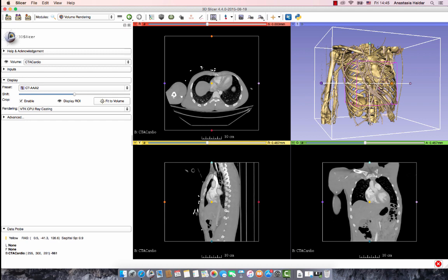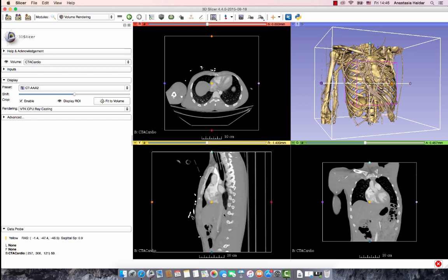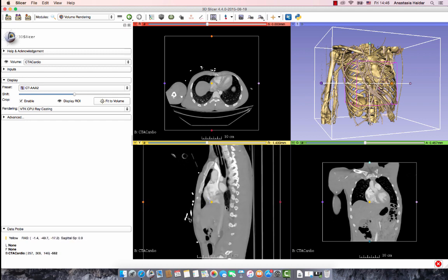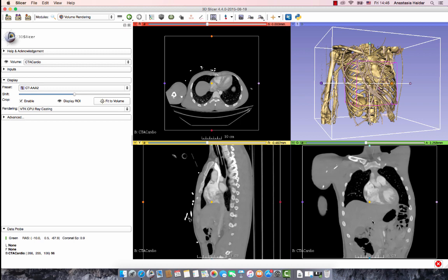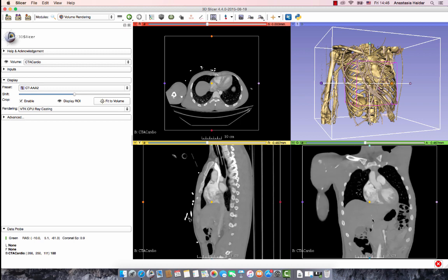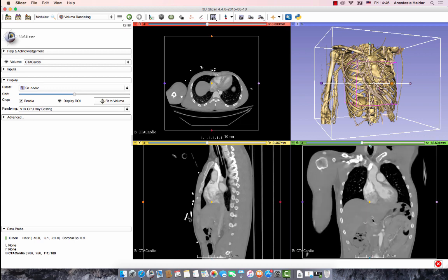Next, click on the ROI to display the region of interest. This will crop the image to the specific vertebrae you need to segment. Zoom in and out as needed to locate the vertebrae, making sure that the vertebrae fits inside the ROI box.